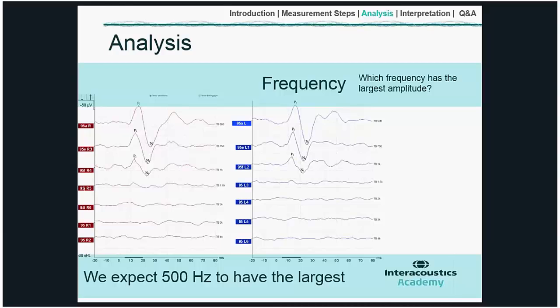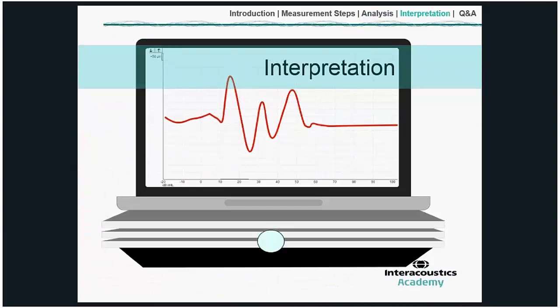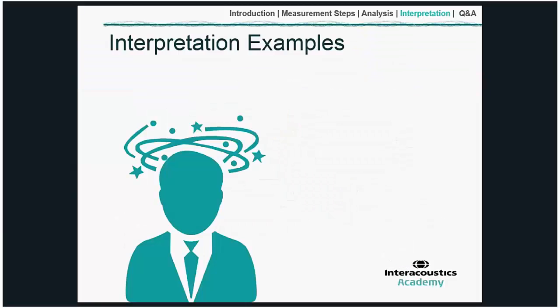And what happens if that's not the case? Well, we can actually look at some examples of these different parameters depending on which vestibular pathology the patient has. When we talk about interpreting the VEMP, from your patient history you would have an indication of which pathology you suspect, and then you're going to be testing the VEMP to see if that pathology is actually confirmed by a diagnostic test. And therefore when you are doing your VEMP test, that would guide you on whether you're looking for asymmetries, thresholds or frequency tuning of VEMPs.